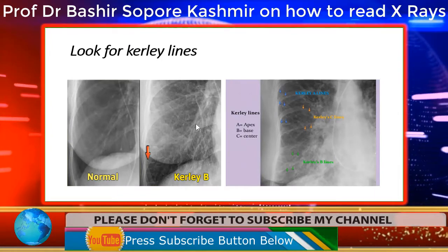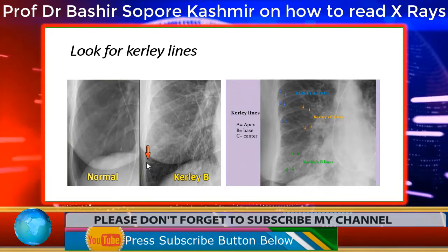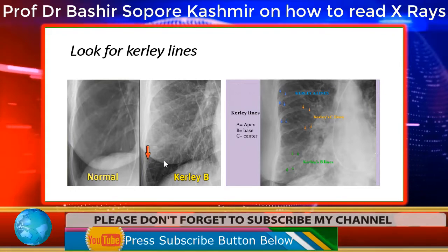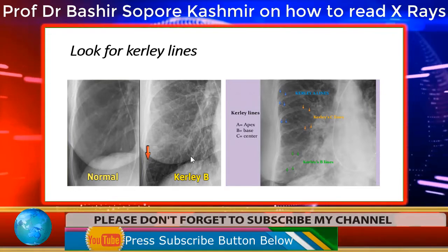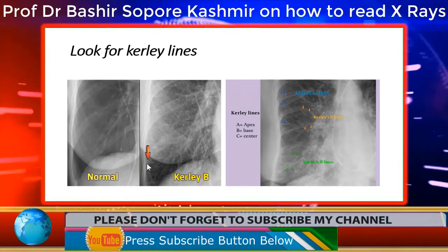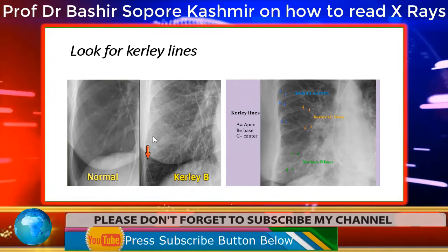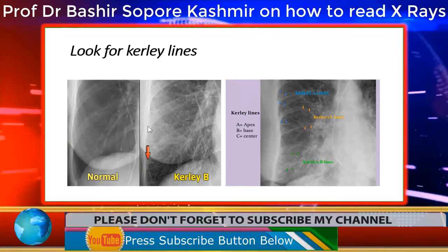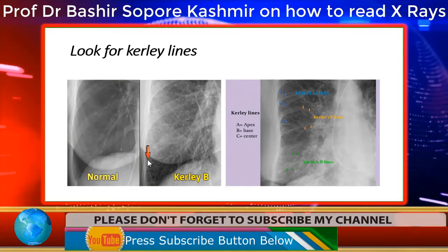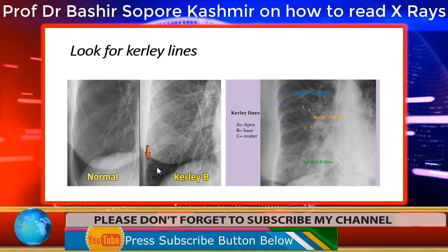We can also sometimes see horizontal linear opacities which run from the periphery towards the center of the lungs, but only up to a few centimeters. These horizontal lines are called Kerley B lines. So if you find horizontal lines from the periphery towards the center running up to a few centimeters, you can call them Kerley B lines.